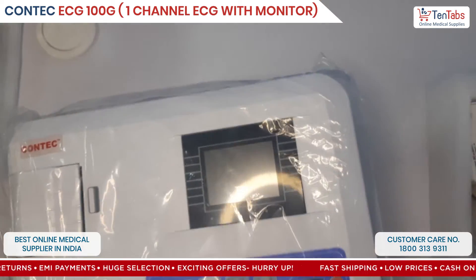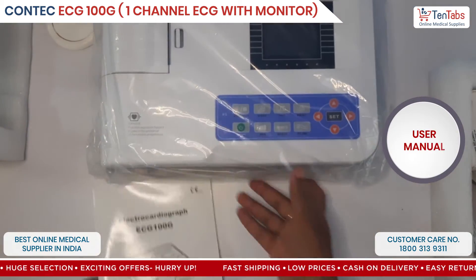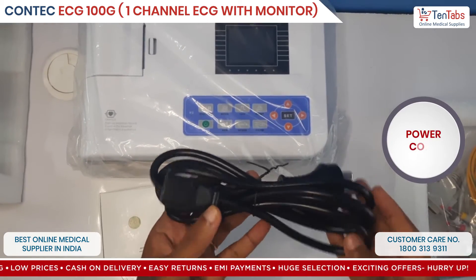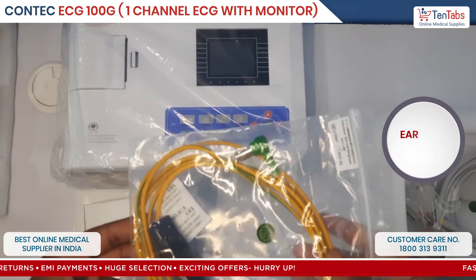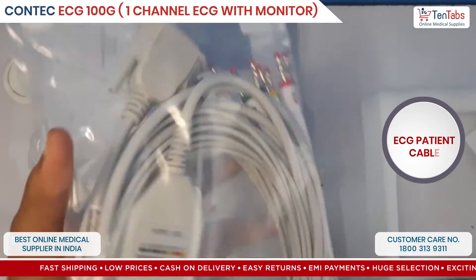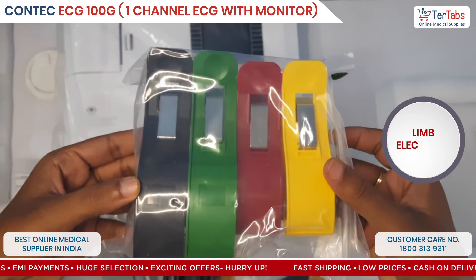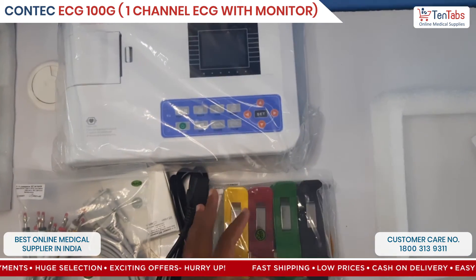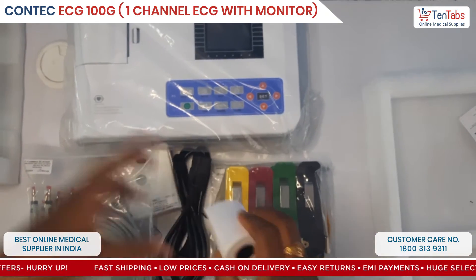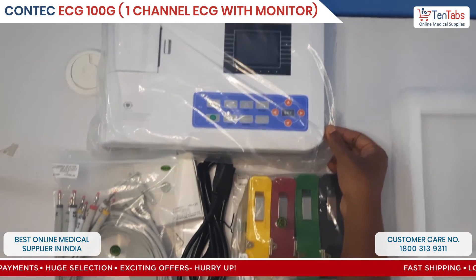Here is the ECG machine user manual, bulb electrodes, power cord, ground lead, patient cable — this is a 10-lead cable — clamp electrodes, and paper roll. So this is everything included in the box of the KONTEK single channel ECG machine 100G.